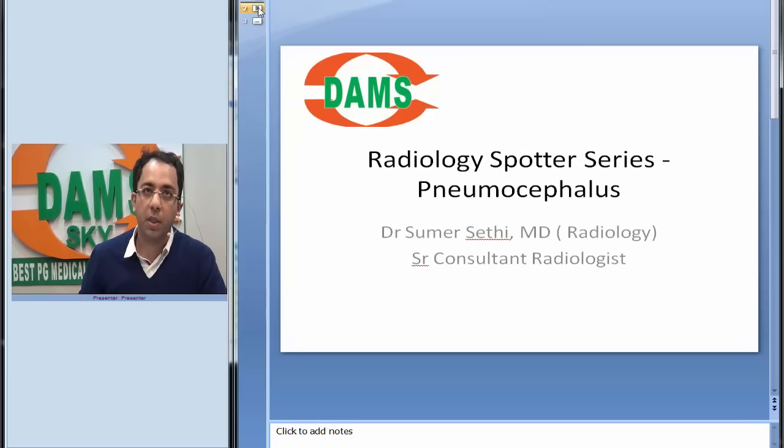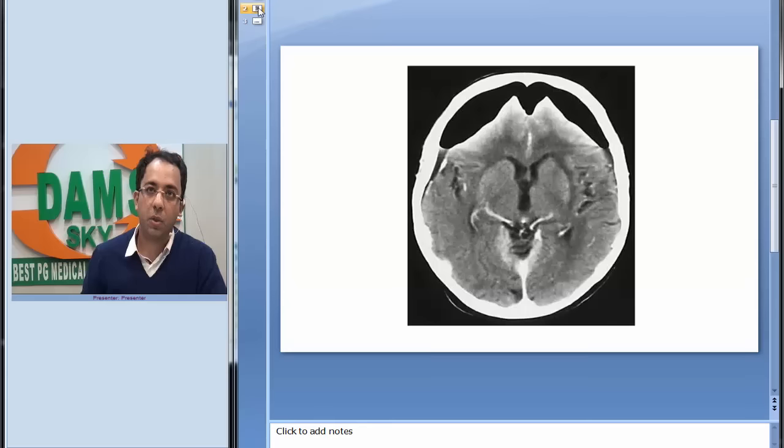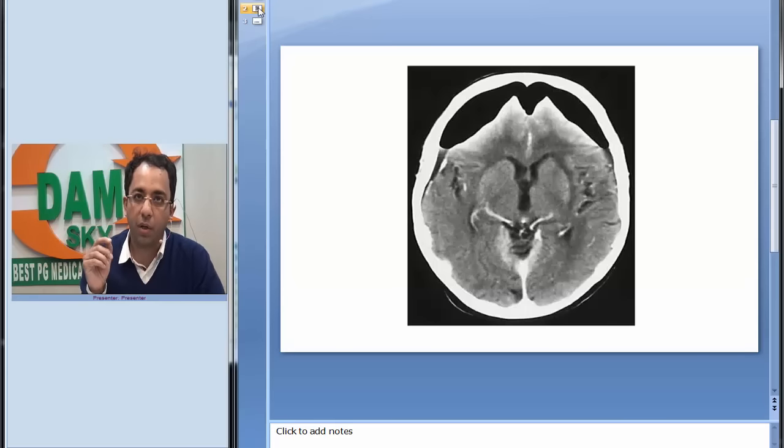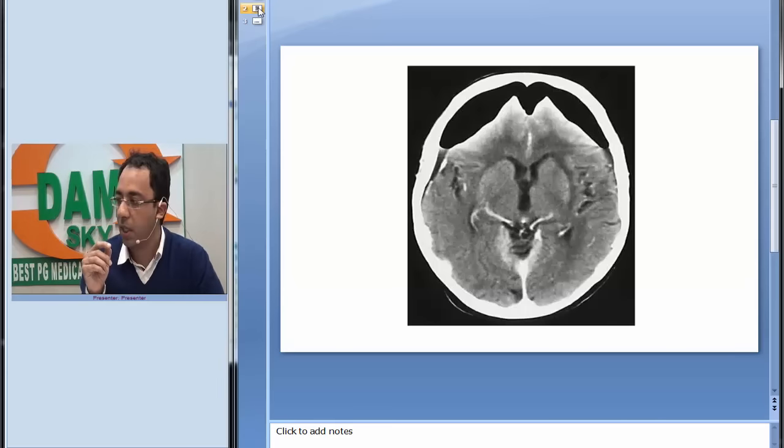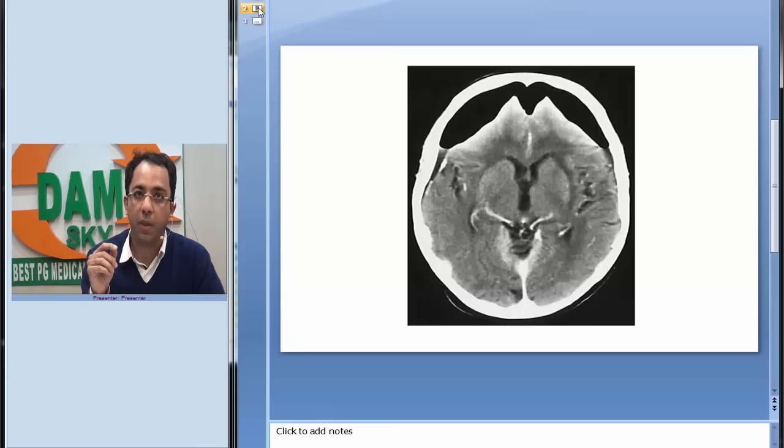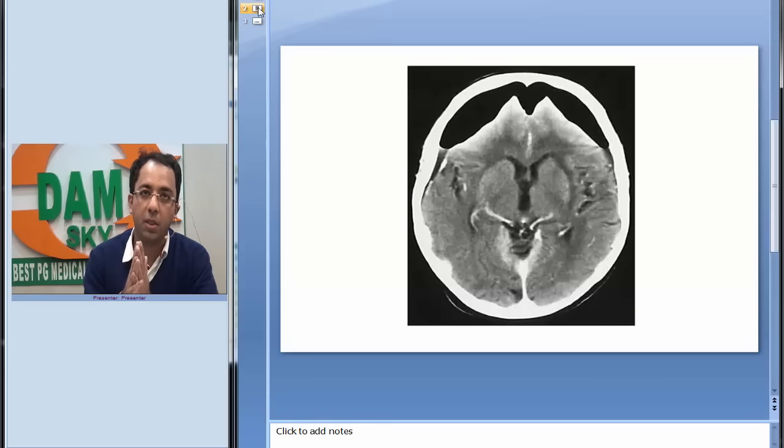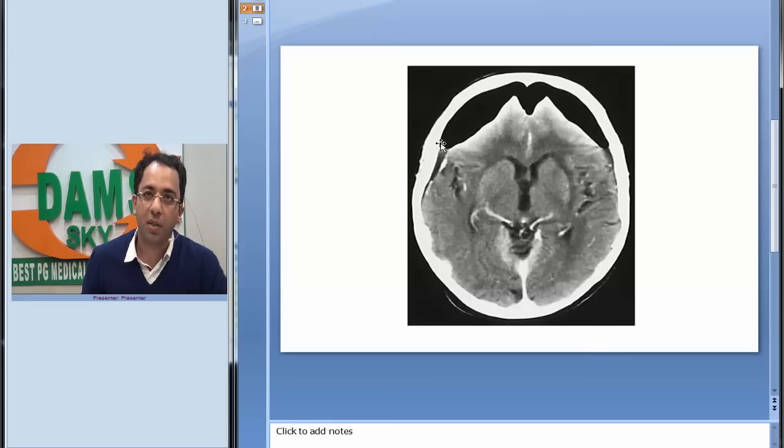In front of you I have put up a CT scan image in which you are able to see some typical finding. What do you see? If I try to show you, you can see this is the bone, this is the brain.